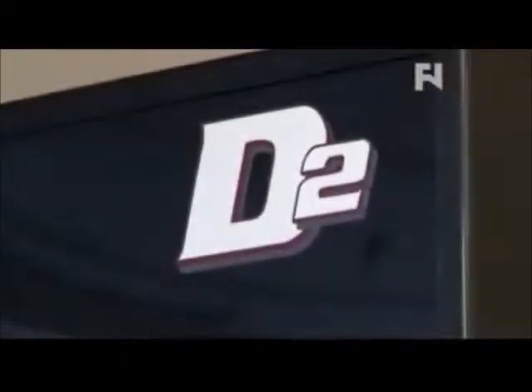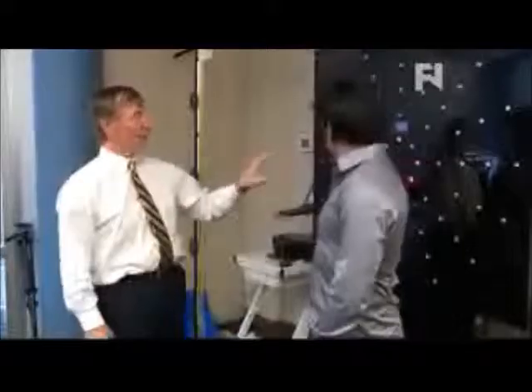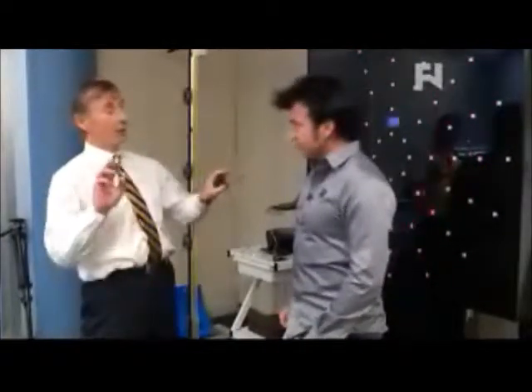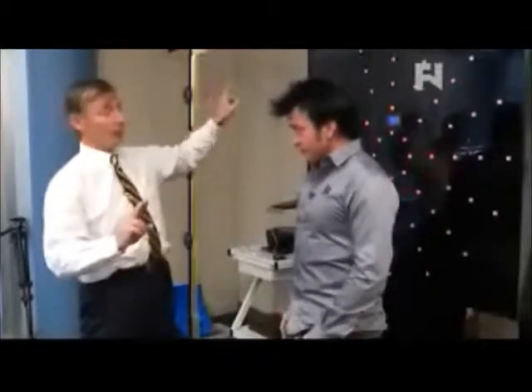Now, we talk a lot on the show about training your brain and how important the brain is for fighters, how important it is for just about any athlete these days. So what is this thing and how does it work? Well, you'll see the red targets down here. In this machine, we're going to set up the first run, whereas a red light will come on. As soon as you see the red light come on, you've got to turn it off, and then that triggers another light to come on. So you're going to chase red lights all over the board.